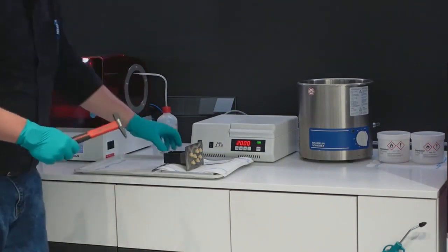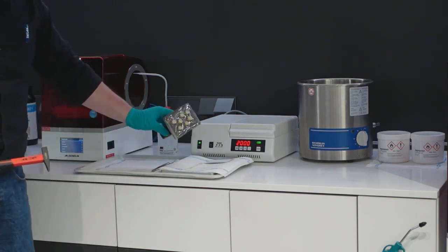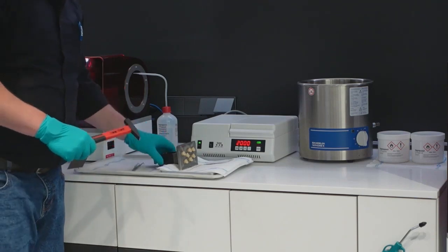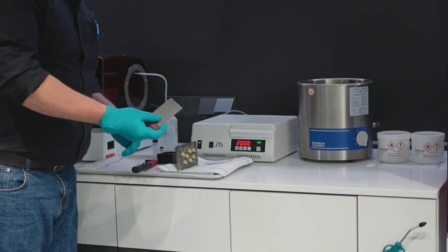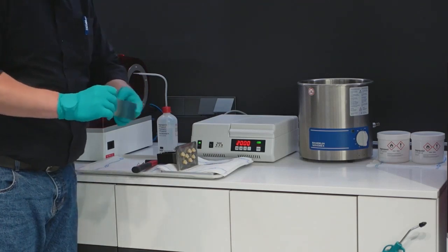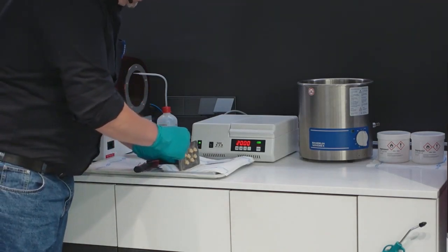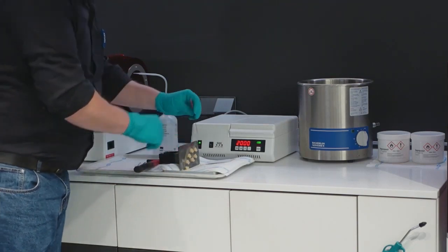Okay, so now you can see here our print part, the last print job. We will take it away from the platform now. You can use a spatula, only a spatula. I love to work with a Japanese spatula because it's really, really thin. You can take it away by hand. Of course, it's not a problem, but you can see it is not so smooth, not so easy.